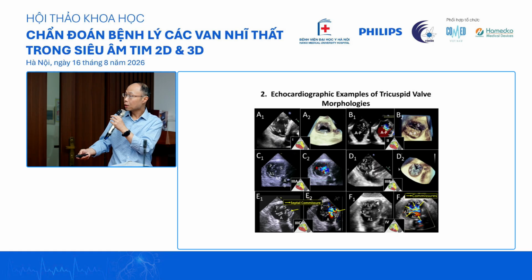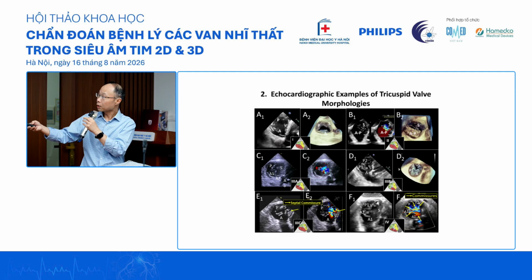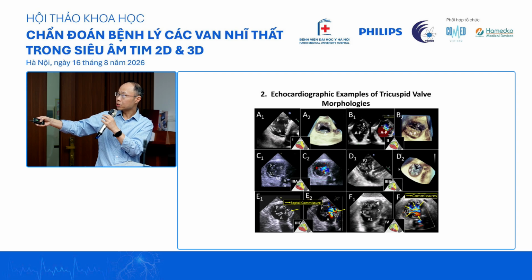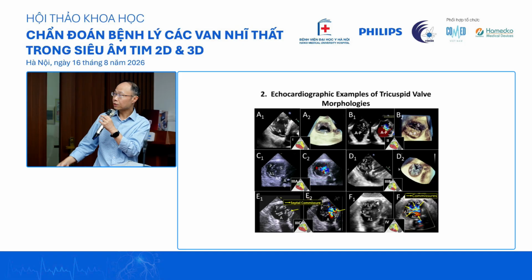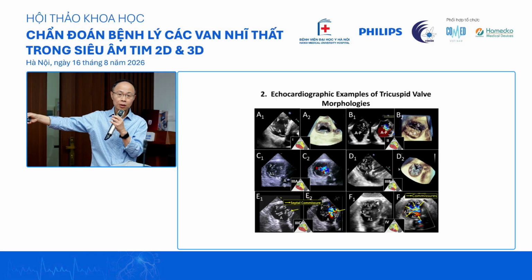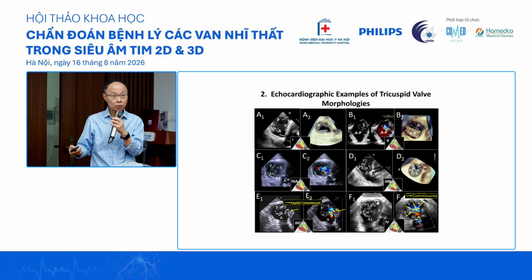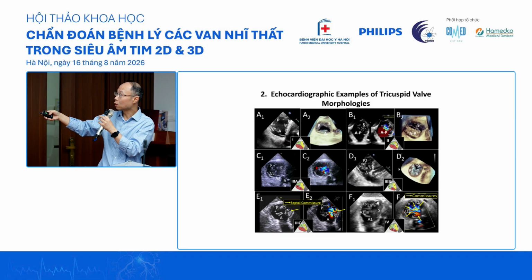So this is just the images from the transesophageal echo of the different configurations. As I mentioned earlier, this is what we see 50% of the time. You have a very clear septal leaflet. That's the one which is right next to your right ventricle. What we do is that by placing your aorta at the 5 o'clock, you always get this as anterior and this as posterior, and that actually helps, because if you don't put your aorta over here, you can get lost, right? It's just like getting lost in a very big shopping mall.